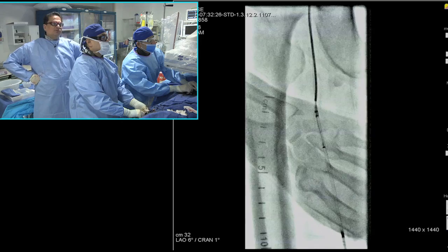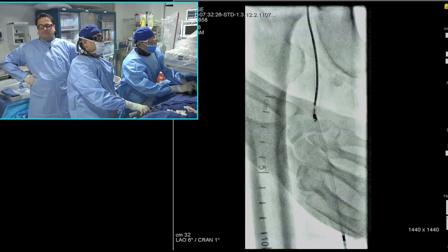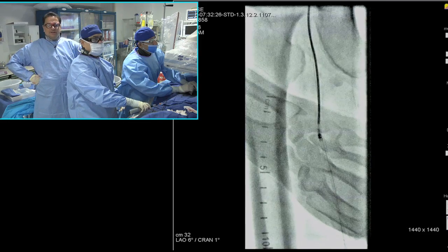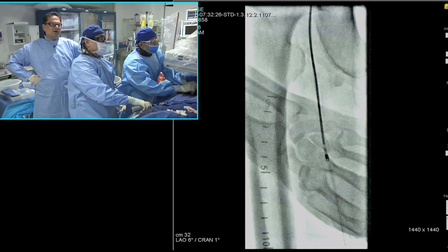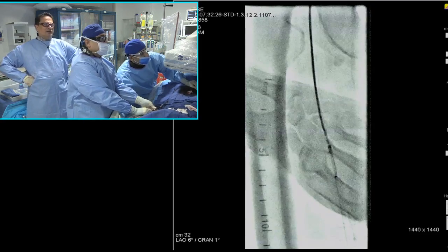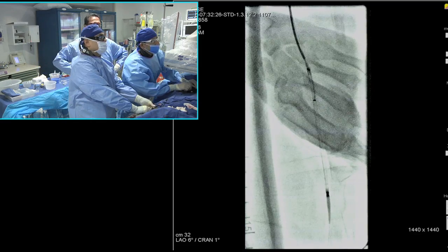So our filter use is judicious, but I think it is not small because we're very, very aware of where we think the filter needs to be used. So here, as you can see, Dr. Jain is doing 2-quadrant, 3-quadrant, I think he's in his 3rd quadrant atherectomy. Since it was a pretty totally occluded vessel, we're probably just going to do 3-quadrant atherectomy here. He's trying not to gutter back into the quadrants.